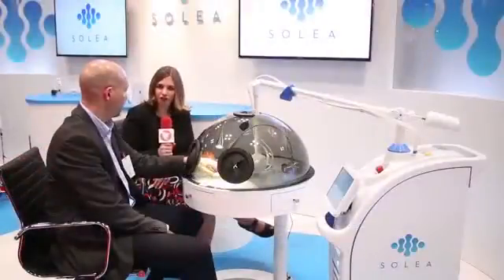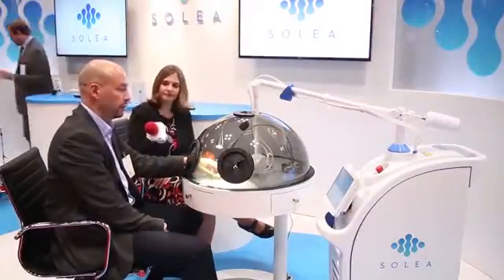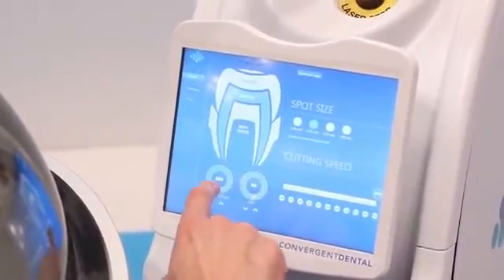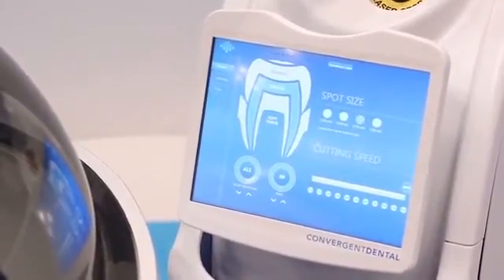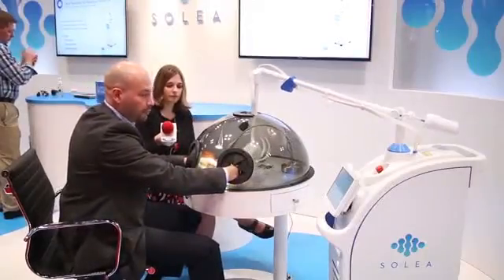Can you show us hard tissue now? Sure. So we'll do a preparation, a class two preparation of the tooth structure, which would be in between two teeth. We'll just select the setting, activate the laser, wait for it to prime. Hear the five beeps.